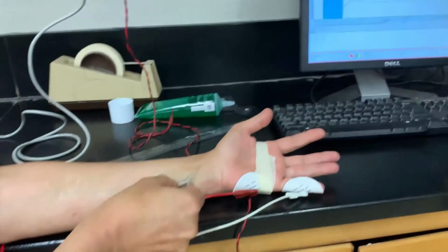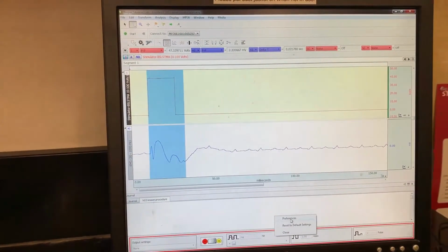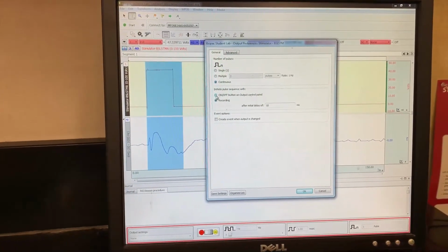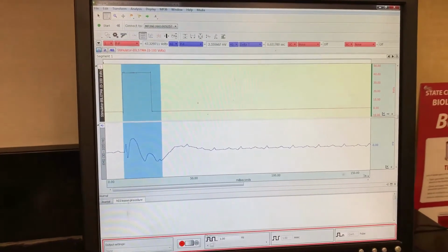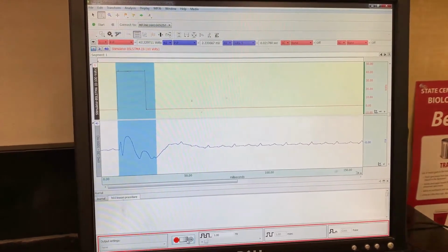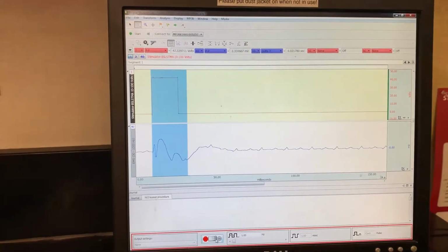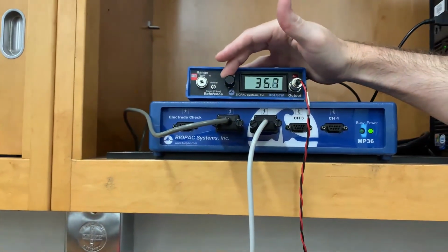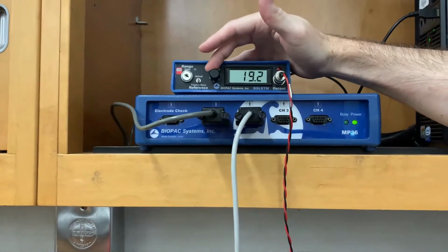And then I'm going to go back onto the computer screen and do the same thing we did for the first one. So we're going to change the preferences. We're going to change it to continuous on-off recording. And then we're going to activate the stimulator to find the stimulation point. But before we do that, we have to make sure that we lower the voltage. So we don't want to start at the 45 that we left off at. So we're going to go back down below threshold.